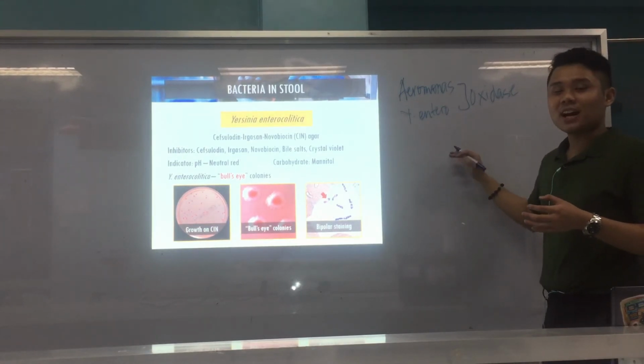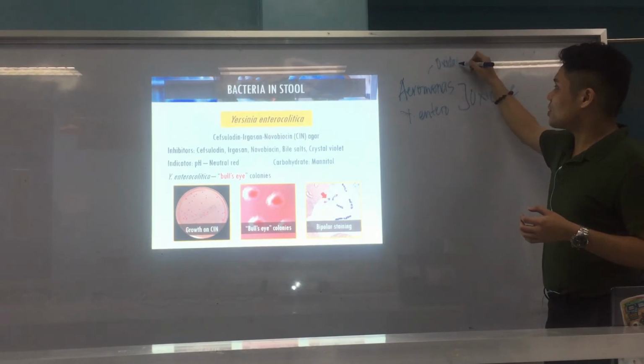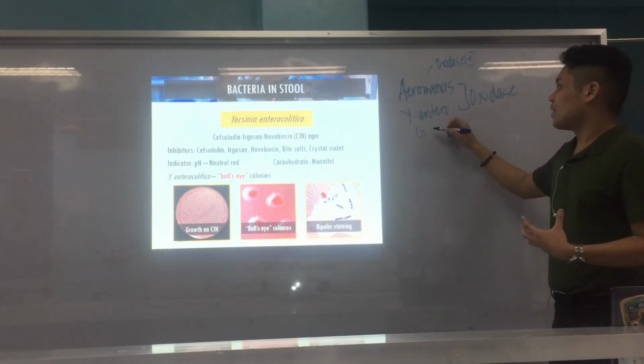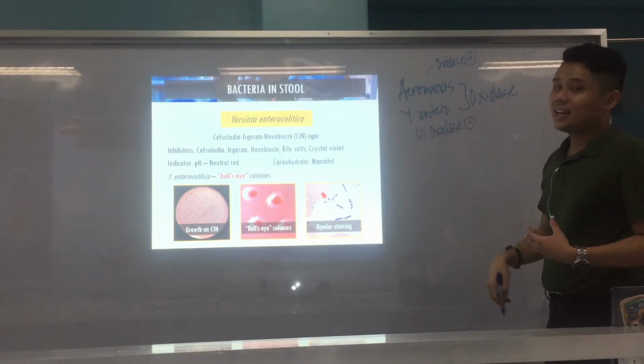Recall the oxidase test. Aeromonas is oxidase positive, right? It is similar to the Vibrios. And Yersinia, which is an enteric organism, is negative. Recall, all your Enterobacteriaceae are oxidase negative.